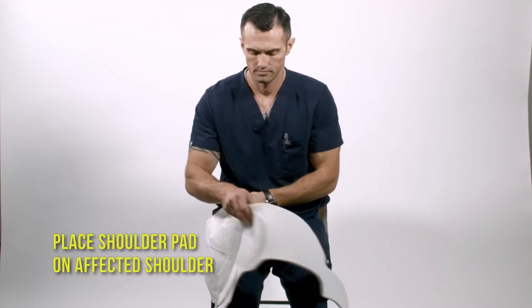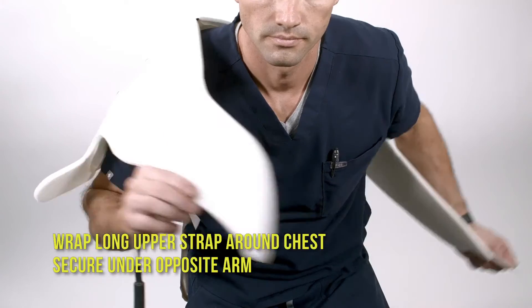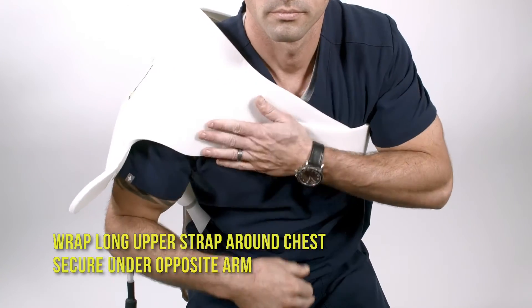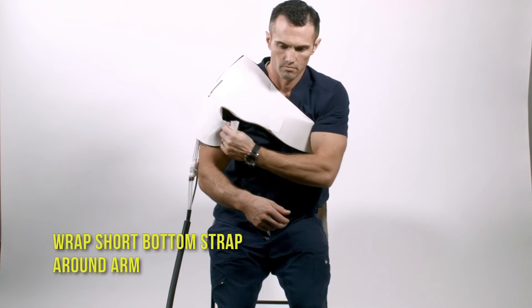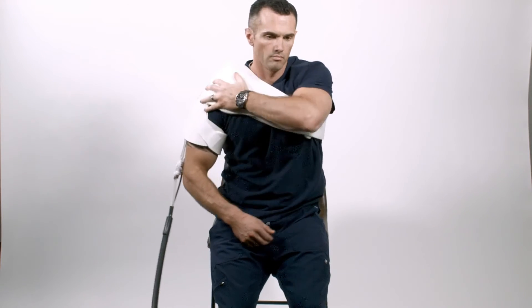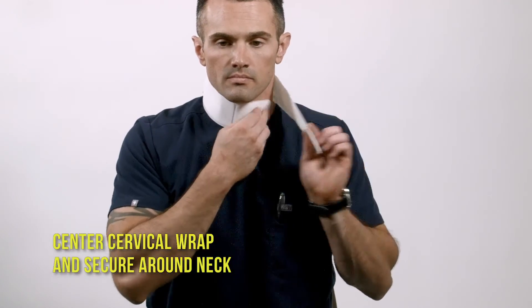Wrap under the opposite arm. Wrap the short bottom strap around your arm. Center the cervical wrap and secure around your neck.